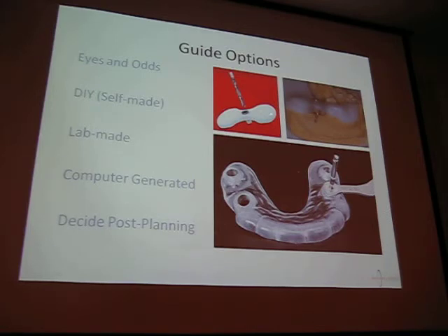And there's a company called AZ Surgical, founded by a surgeon in Mountain View. And they make these little things called Easy Stents, 30 bucks each. That's all they cost. You throw them in hot water, this acrylic heats up, you put it over a model, you angle it how you think it should go, you drill a hole, this cools, and you've got yourself a guide. And hey, for 30 bucks, it's something, right? You can have your lab make one for you.